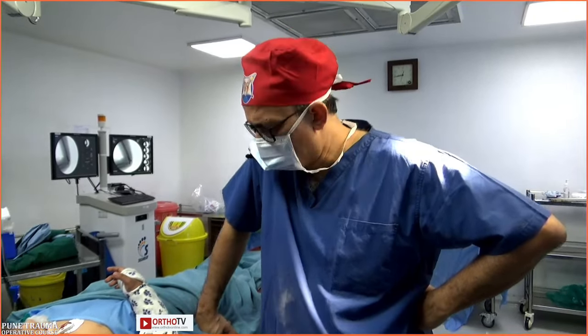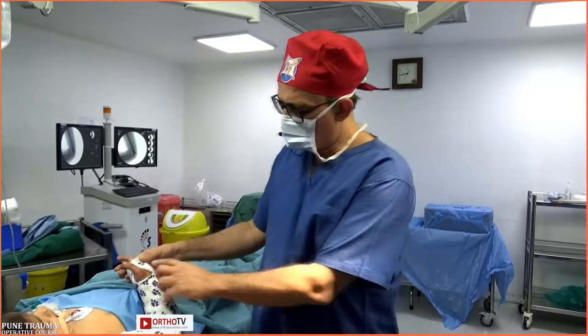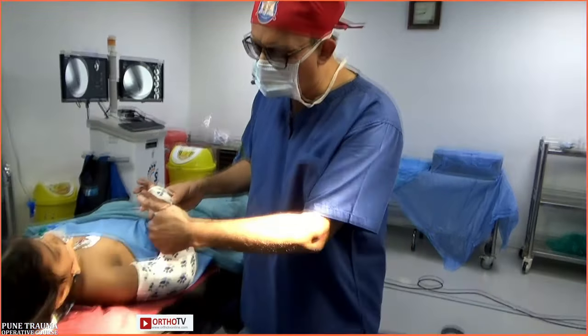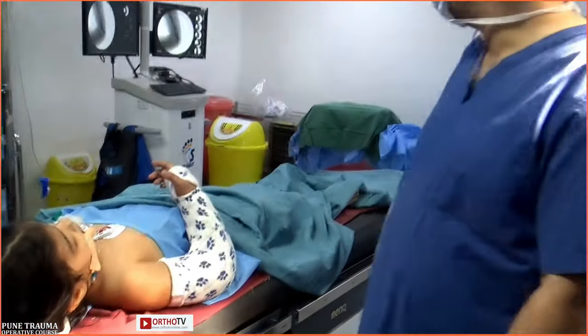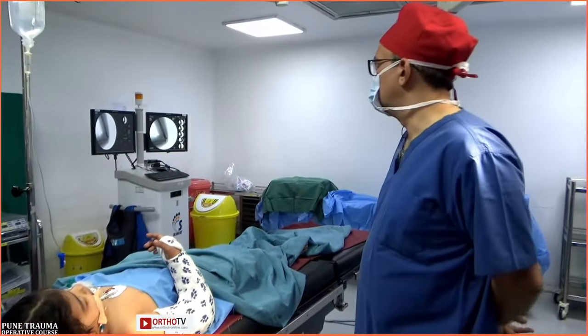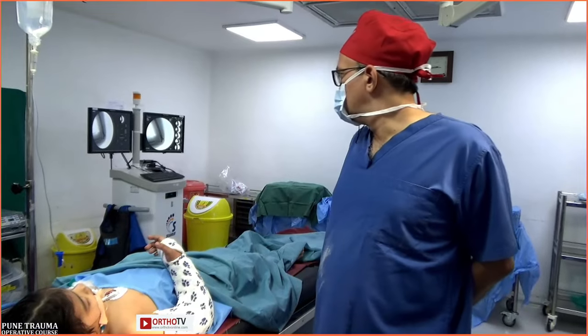Right. And the way you plastered it, a very loose kind of plaster. Yeah, so these small tricks, I think, help. If you see the lateral x-ray, there is a lot of gap between the plaster and the skin. So that also is seen very well.